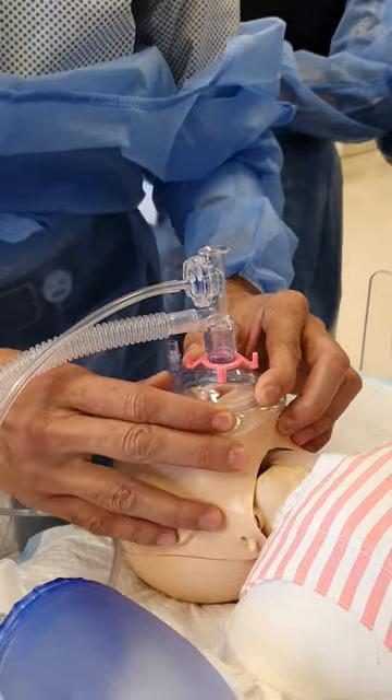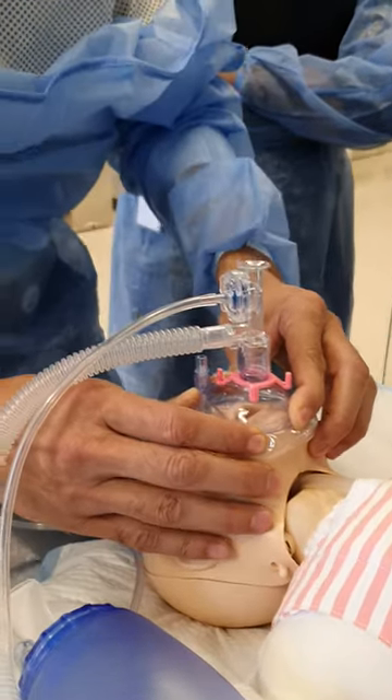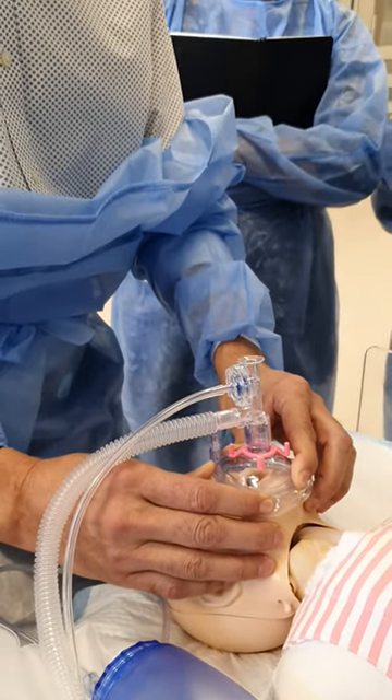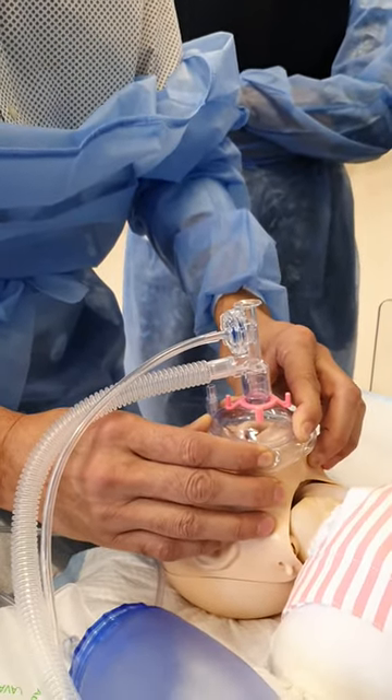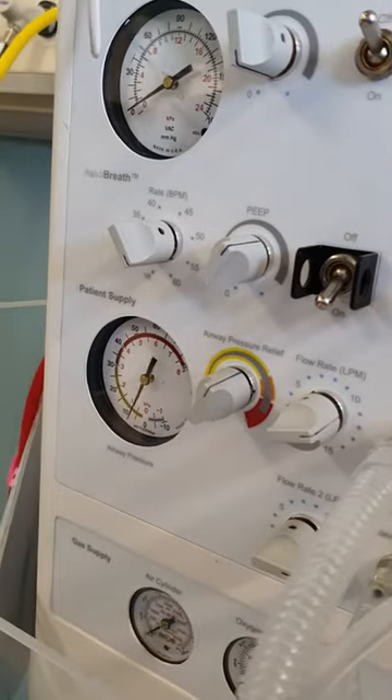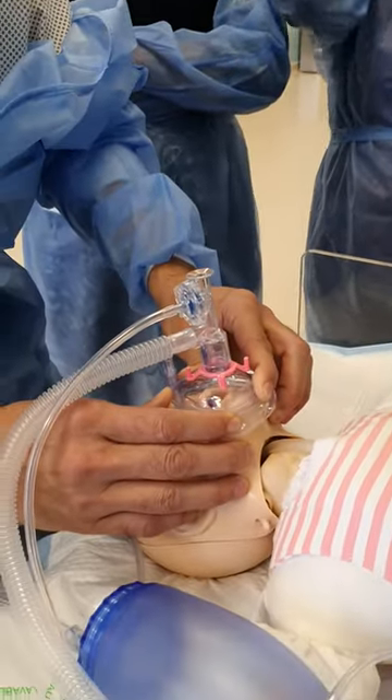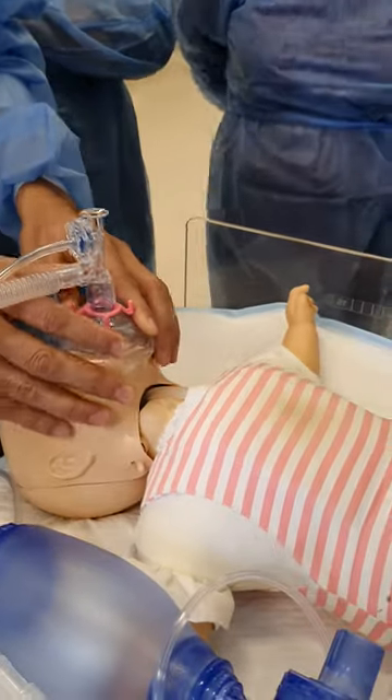You need this sometimes — if you're using both hands, you can use both hands. This mask is a little bit big for this baby. You can see chest rise right here. Somebody else want to try?